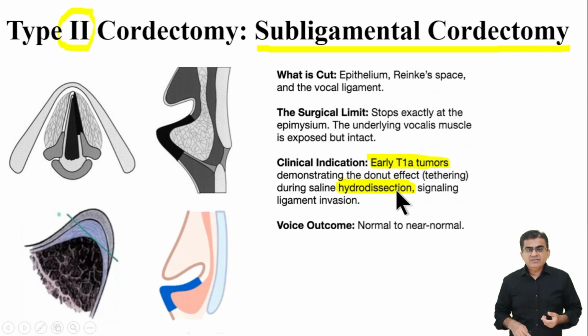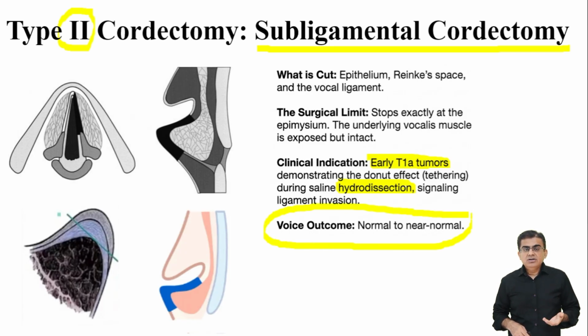Because we safely preserved the thick vocalis muscle, the functional result is still highly favorable. The patient will generally heal with a very good, normal to near normal voice.